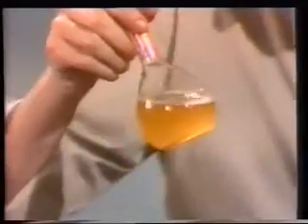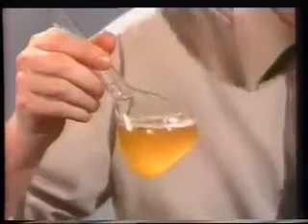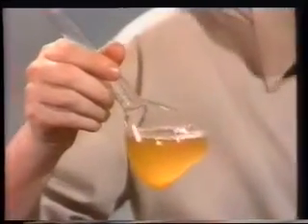Another simple point that often escapes us. Sometimes the urine, when you pass it, particularly first thing in the morning, is cloudy. And this is another example of normal urine, and it just happens to be cloudy. And urine passed first thing in the morning may well be cloudy. This cloudiness is often due to deposits of phosphate or sometimes of urate.